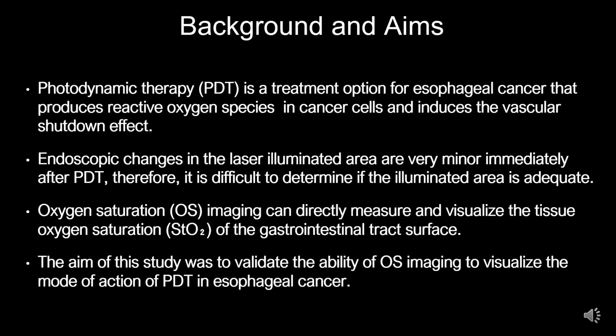Oxygen saturation, OS imaging, can directly measure and visualize tissue oxygen saturation, StO2, of the gastrointestinal tract surface. The aim of this study was to validate the ability of OS imaging to visualize the mode of action of PDT in esophageal cancer.